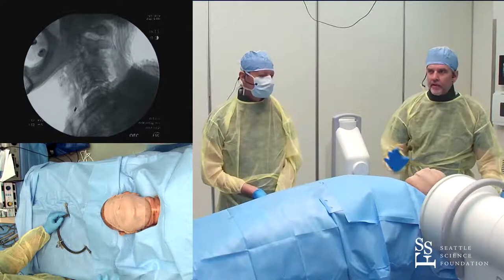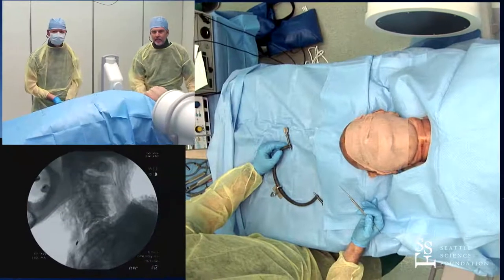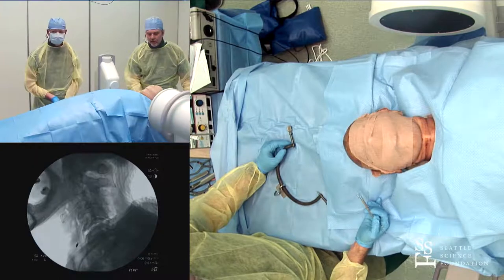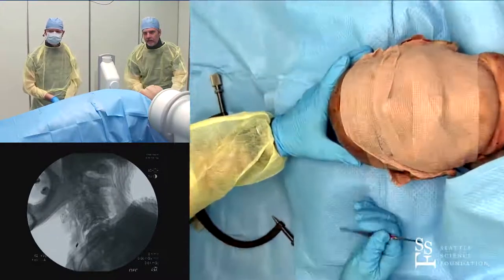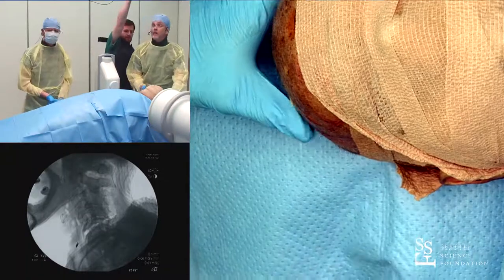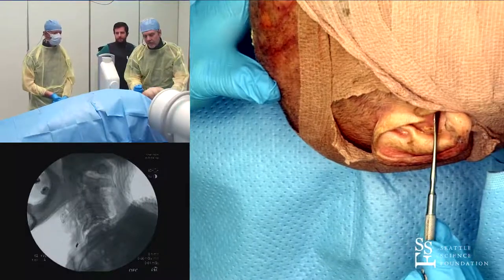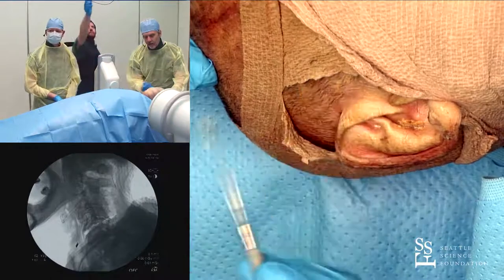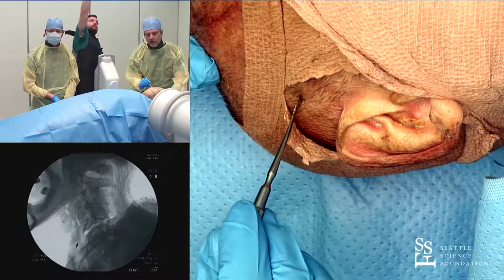Let's forget for a second what kind of injury we have here, and talk about what we're going to do. The first part is applying the tongs safely so that they don't rip through the skull or cause an epidural hematoma. What I do is figure out where the external auditory meatus is, where the pinna is. I'll go a fingerbreadth above the pinna, in line with the external auditory meatus — right about there will be my entry point.